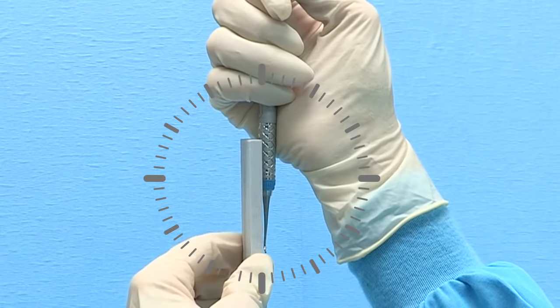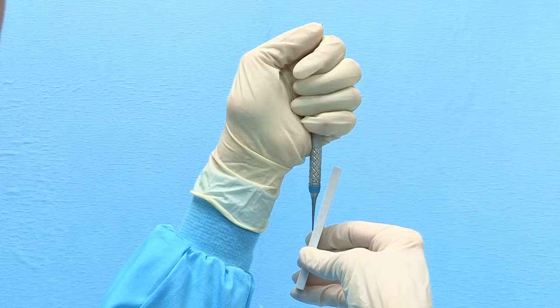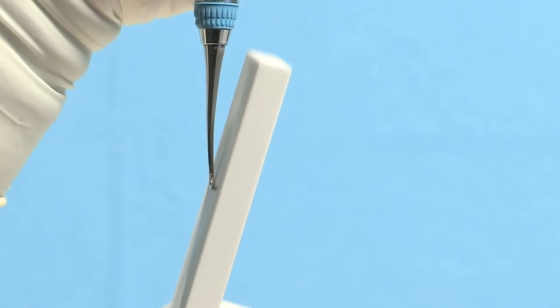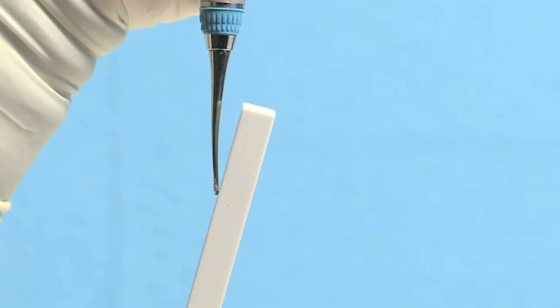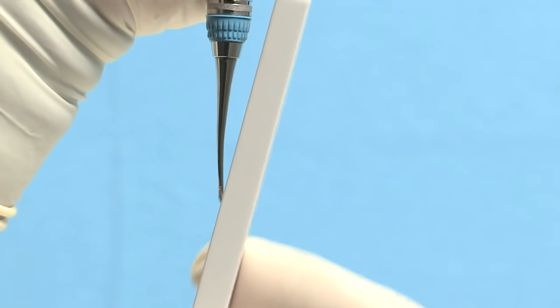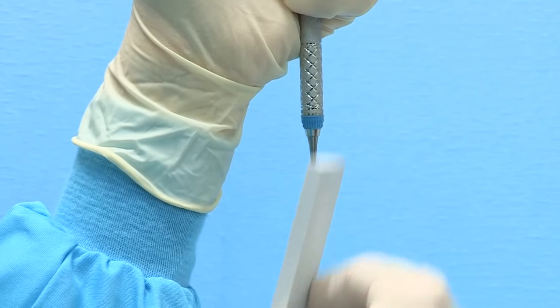Left-handed clinicians will tilt the stone to approximately 3 minutes before 12 o'clock. Initiate sharpening in a fluid up and down motion, starting at the heel third of the blade and slowly progressing by moving the stone to the middle third and finally to the tip third. Maintain the stone in a continuous up and down motion using long strokes and moderate pressure, and finish on a downward stroke.